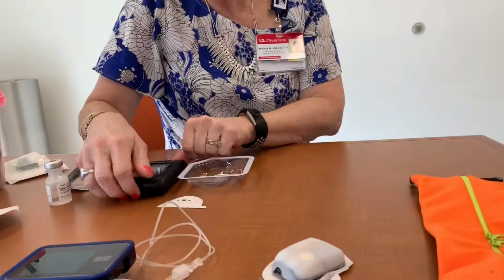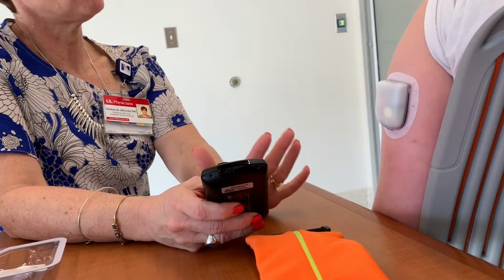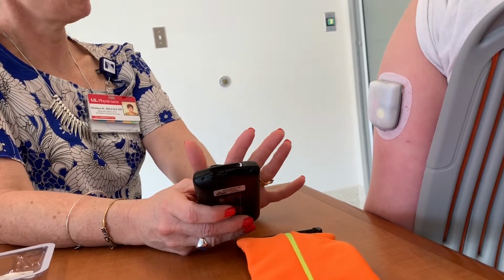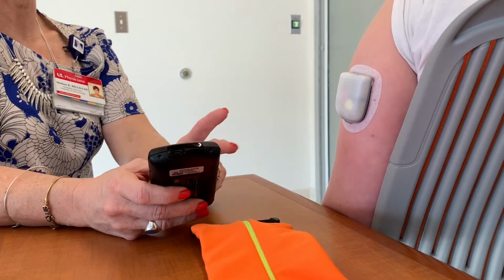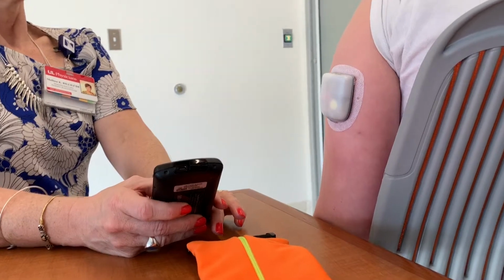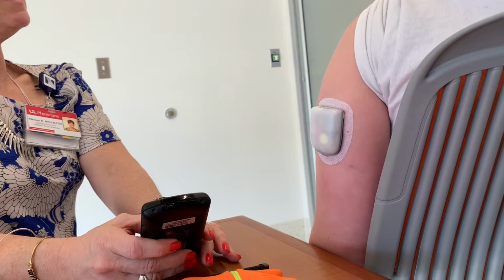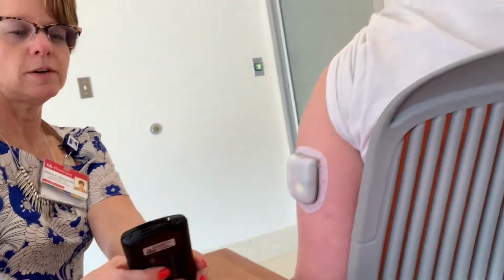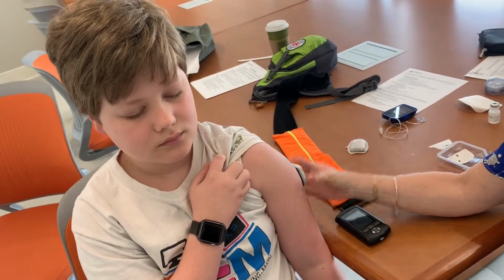Okay, all right. So I'm gonna hit start. When I do, you're gonna hear 5 clicks and a snap, okay? So I'll count them. And when we start hearing clicks, I need you to take 2 nice deep breaths. Can you take 2 deep breaths with me right now? And then 1 more. Okay, so when I start counting, I want you to take deep breaths. 1, 2, 3, 4, 5. Done.